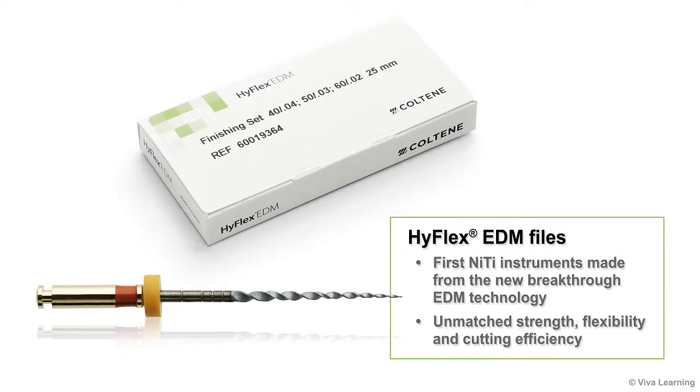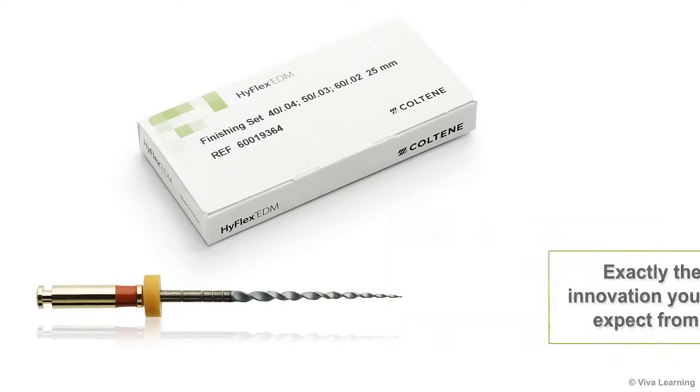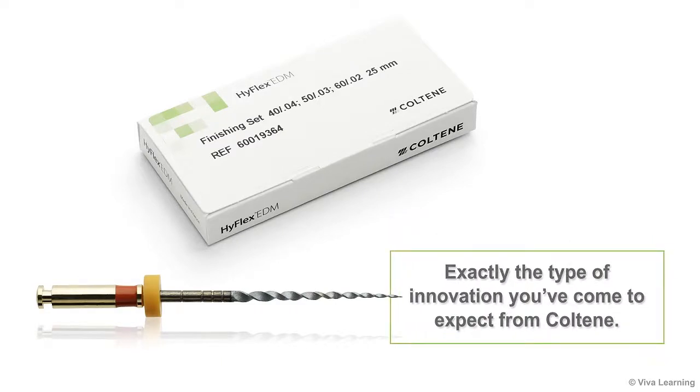In summary, HiFlex EDM files are the first NITI instruments made from the new breakthrough EDM technology. HiFlex EDM files give you unmatched strength, flexibility, and cutting efficiency for the preparation of even the most complex canals — exactly the type of innovation you've come to expect from Coltene.